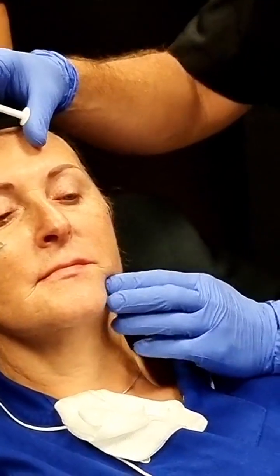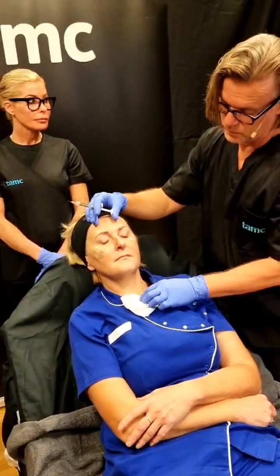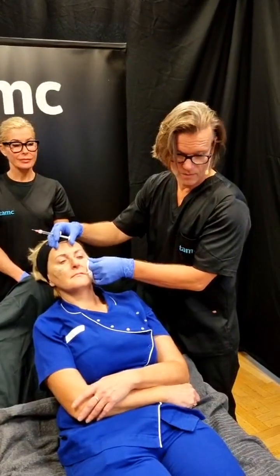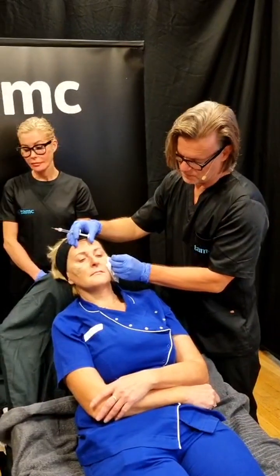The audience asked what's the name of the product. Can I tell them? Yes, of course, Tom. It's Restylane. It's Restylane.